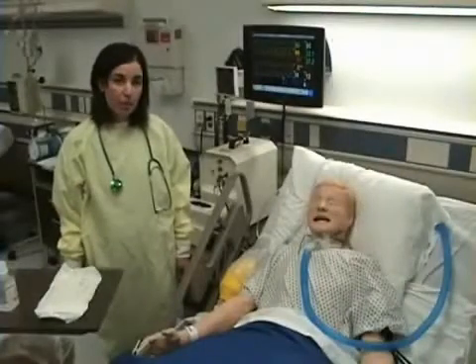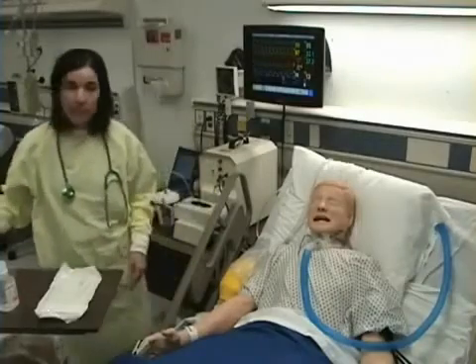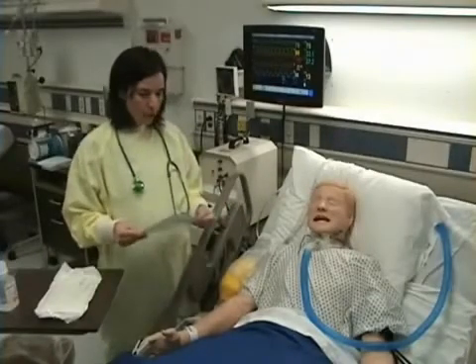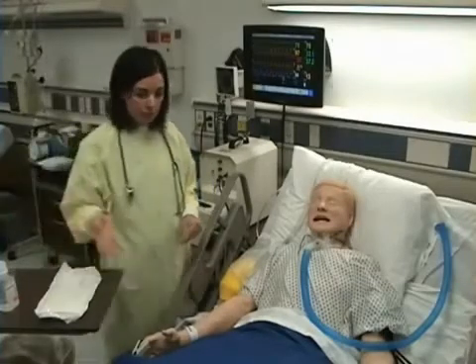This is how to suction a patient with a tracheostomy. First, I will begin with checking my patient's orders. It's necessary to have a physician order to suction a patient with a trach, and I see that my patient has an order to suction every 2 hours and PRN. I'm going to enter into my patient's room.